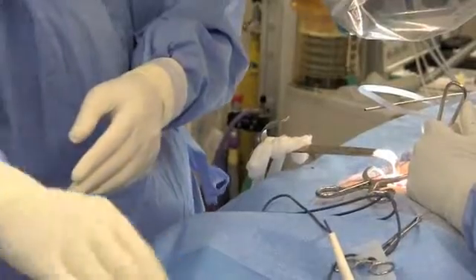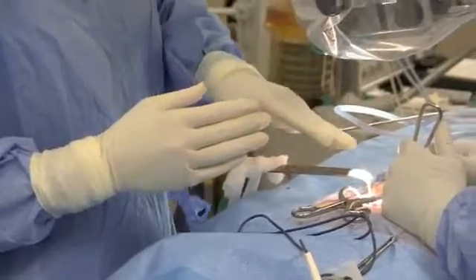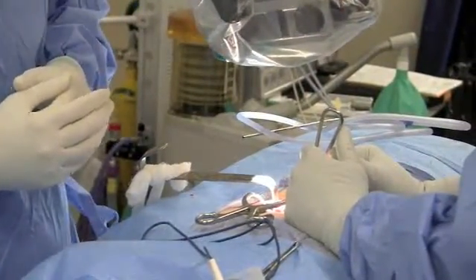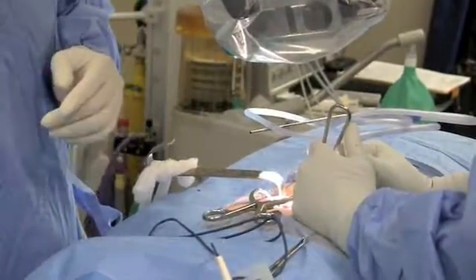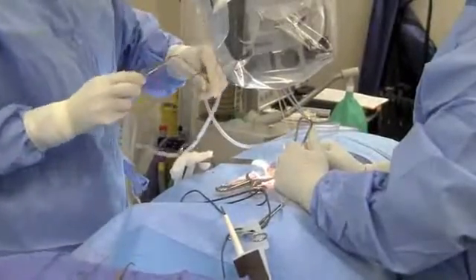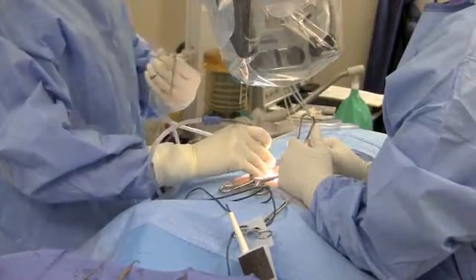We've got the retractor in place and we've got a micro nerve root retractor there — we're holding that. We've got some disc there that we see through the microscope. We've already made our laminotomy, the opening that I showed you earlier. Now we're going to reach in with the micro grabber and pull out this small piece of disc to see if we can take away the leg pain.